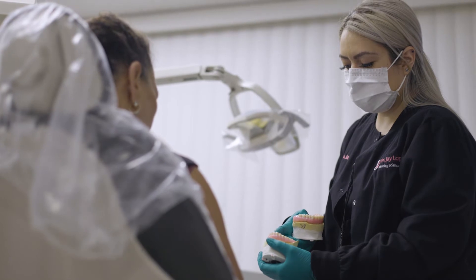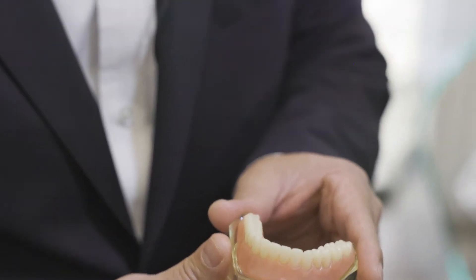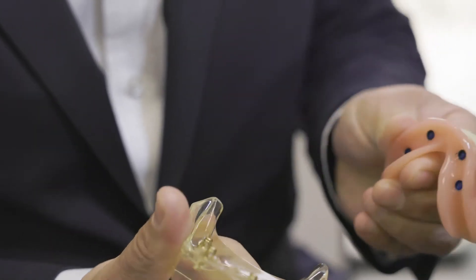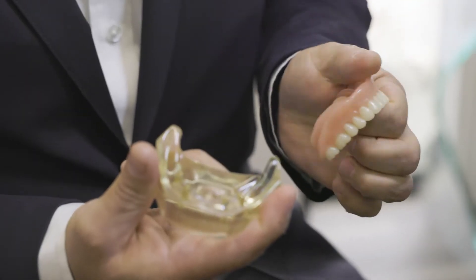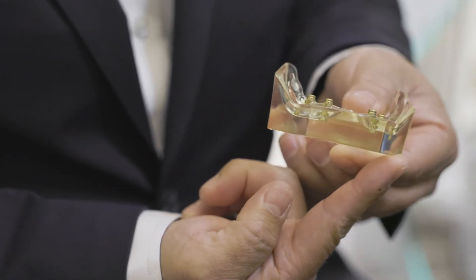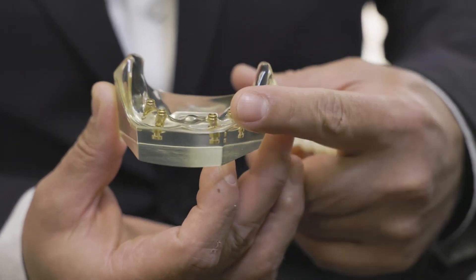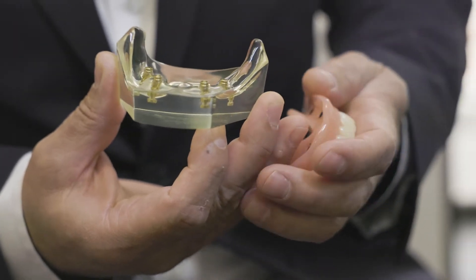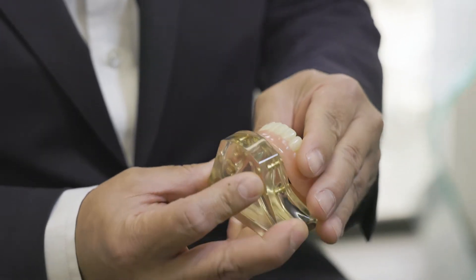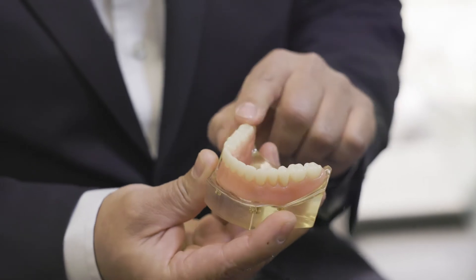Our next option incorporates four implants. This is what we refer to as our snap-on teeth. It's a lot harder to get the denture apart from the implants. We have our four implants — two more towards the front and two more towards the posterior. Each implant is attached to a precision attachment known as a locator, and the inside of the denture has four locator attachments that snap into place. This provides a lot of retention in both the anterior and posterior areas.